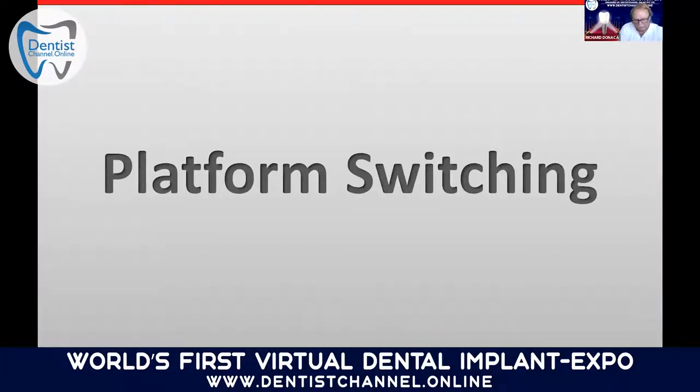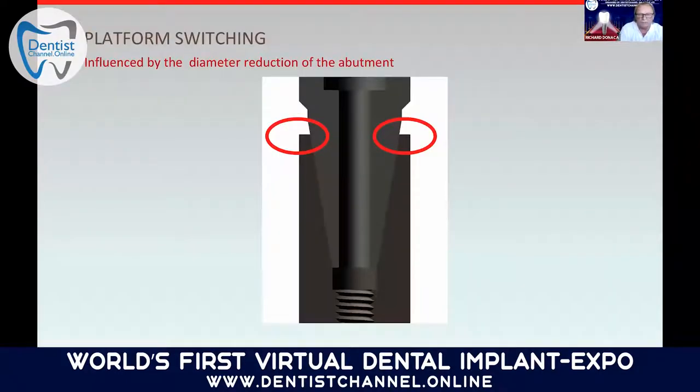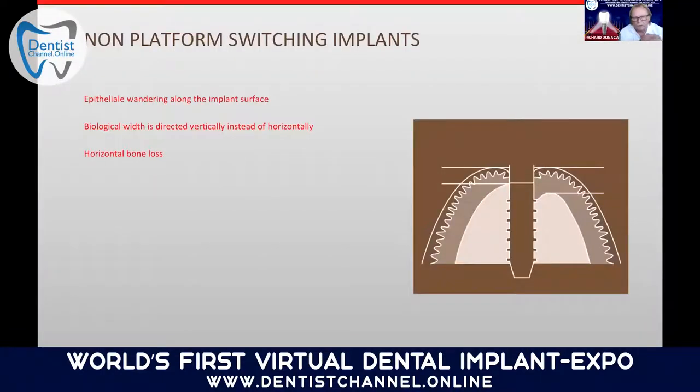Platform switching is something, of course, the companies try to use to help the implant connections that they have. The platform switching is basically taking the abutment and making it smaller than the implant. So it's a reduction of the abutment diameter, which on non-platform switching implants makes epithelial wandering along the implant surface a problem. The biological width is directed vertically instead of horizontally, and horizontal bone loss is also prominent on non-platform switching implants.